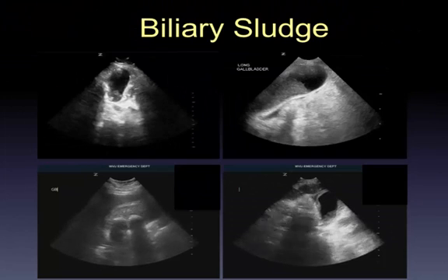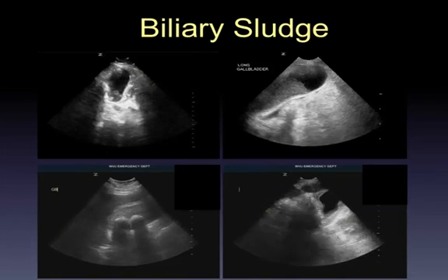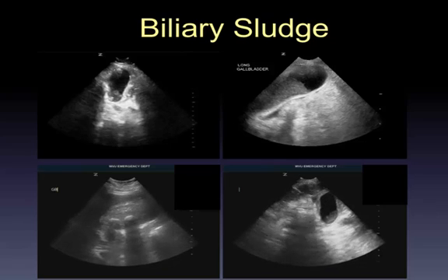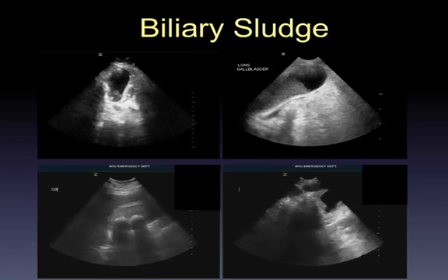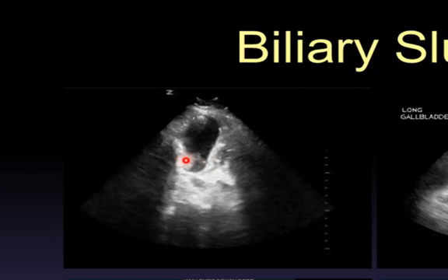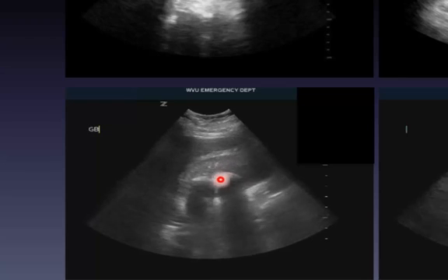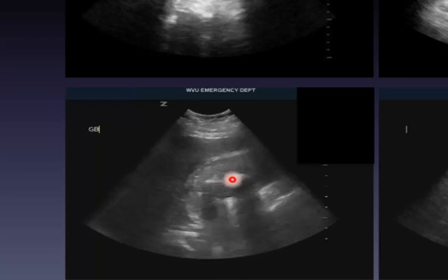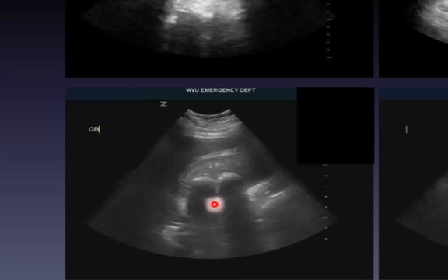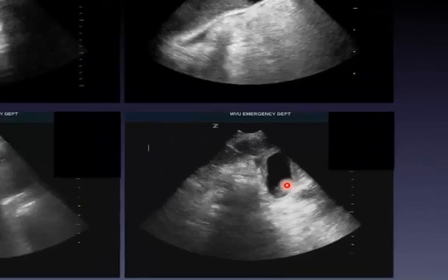Here is some sludge in the gallbladder. Sludge tends to be not quite as echogenic as stones, doesn't generally cast acoustic shadows, and is usually in the more dependent areas. You'll see sludge layering out in the gallbladder. There can also be stones within the sludge that do cast shadows.